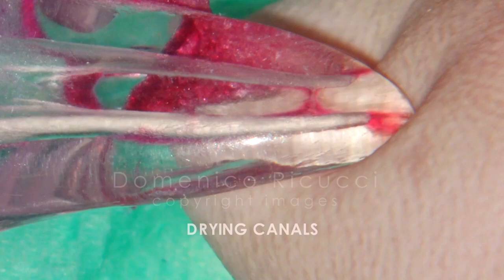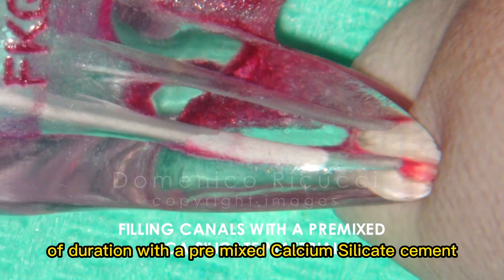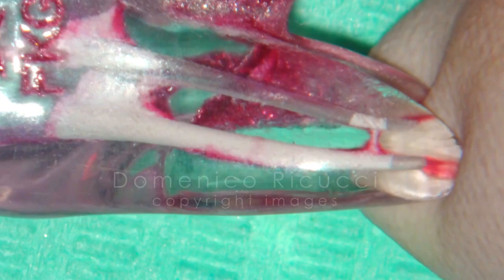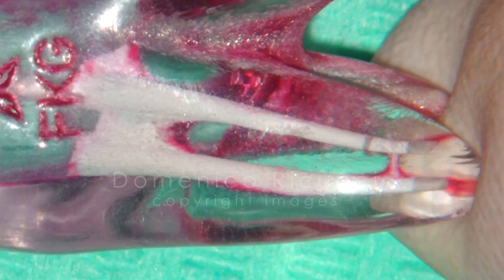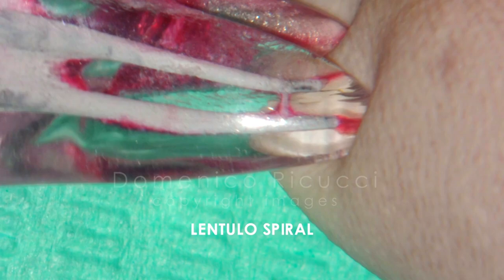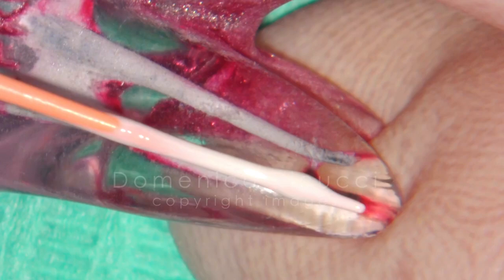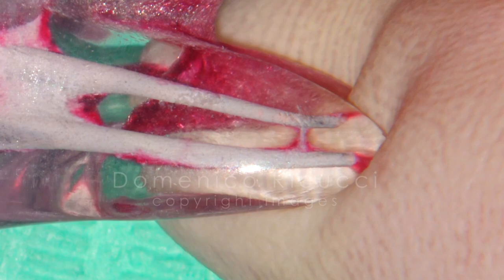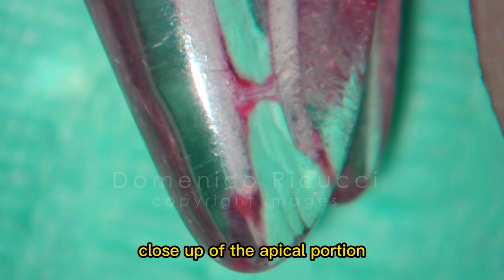Obturation with a pre-mixed calcium silicate cement. A lentulospiral is used to assure the filling of the apical portion. Close-up of the apical portion shows the filling material limited to the apical seat. This is the filling material–soft tissue interface.